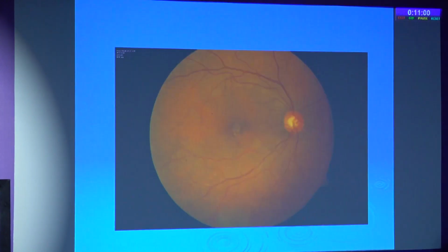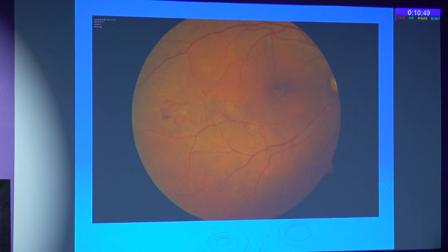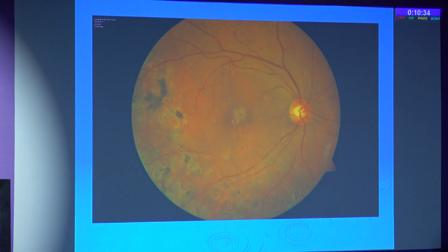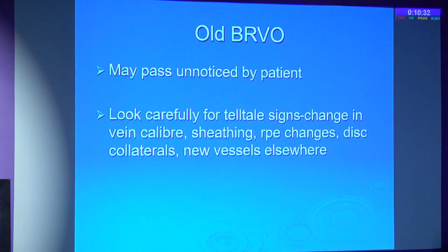This patient, you can see, again looks fairly normal, just a few RPE changes at the fovea, and you can't really explain why there is decrease in vision. If you look very carefully, you can see that there is a neovascularization in the infratemporal area, which means that the patient had an infratemporal branch vein occlusion earlier, which has caused the foveal changes, and that is why the patient has a decrease in visual acuity. This patient underwent sectoral PRP.